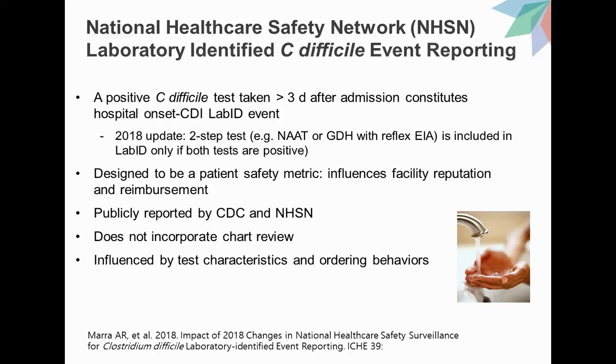So a positive C. difficile test taken greater than 3 days after admission constitutes a hospital onset CDI lab ID event. And when this requirement first came out, any positive C. difficile test was considered a lab ID event. However, in 2018, the National Healthcare Safety Network updated their requirements to accommodate two-step testing. And if a laboratory is using a two-step test, you only need to report this as a lab ID event if both tests are positive. So this does help those laboratories that are using a two-step algorithm. However, it does not help those laboratories who have chosen to use NAT alone as a single test.